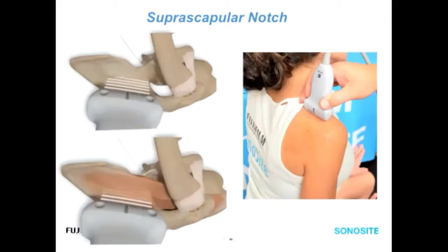So this is a really superior view. Think of that Netter's view of the rotator cuff. We're looking down on the body, looking down on the shoulder. So here's the AC, the supraspinatus going underneath it in the supraspinatus fossa. We can see the beam is planted midline to the supraspinatus, which is like mid-coronal to the body plane. Patient positioning doesn't really matter. The patient can be nice and neutral for this exam.